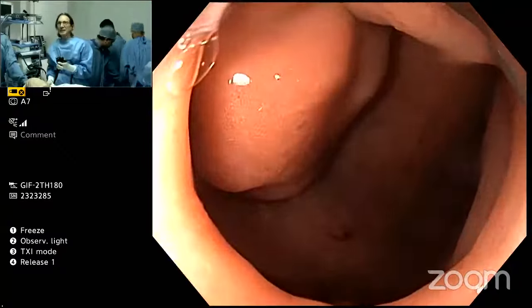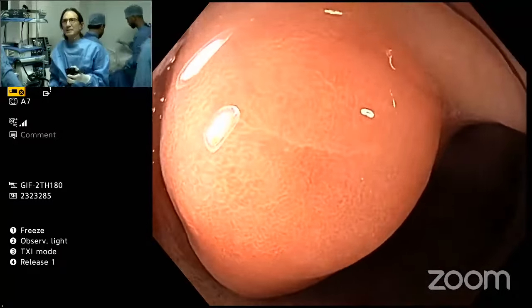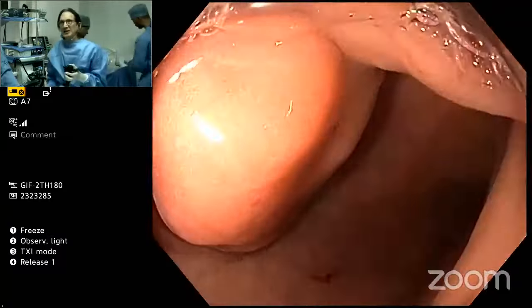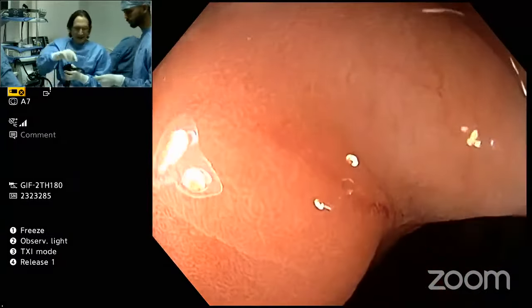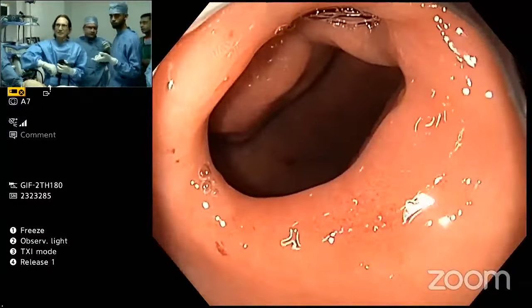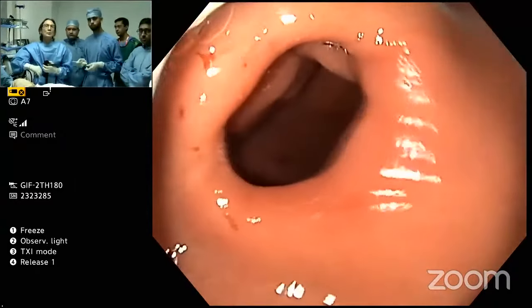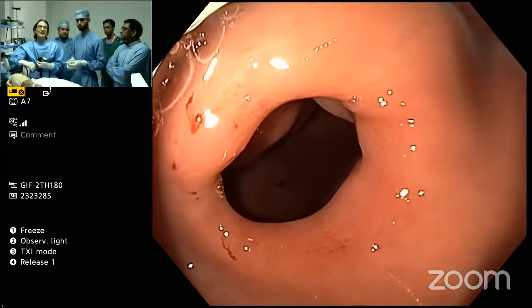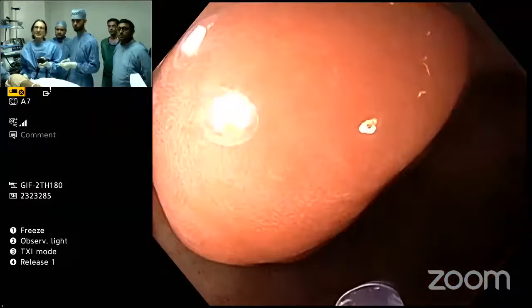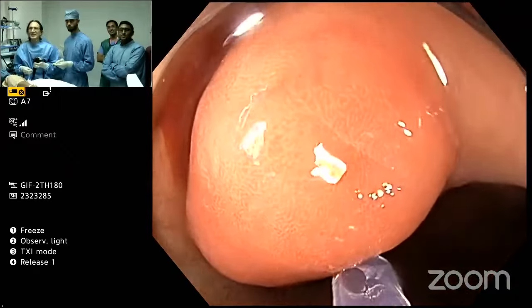So these are all in sort of their first stage of development. I won't call them prototypes really, but they've already been thoroughly tested, and I've used these extensively in animals. So let's give this another shot. Can you explain what you are planning to do? I'm going to retract this, and then I'm going to put the loop over the base, over the suture, retract it, and then I'm going to deploy the loop at the base. Okay, let's just try this one more time. I have to speed up since my hour became 15 minutes suddenly. Okay, can you hold the scope here like this? All right, so let's just give this another try.